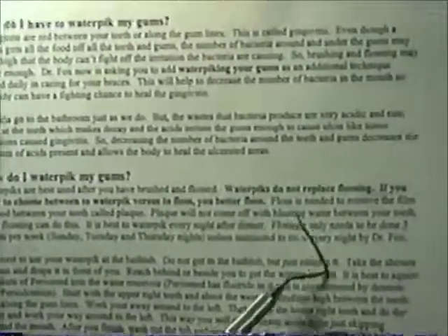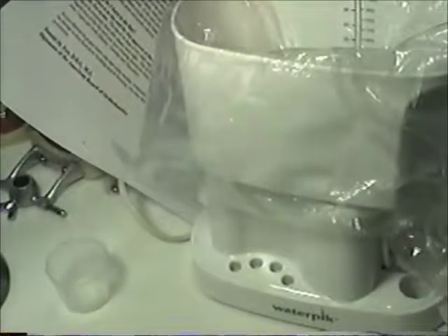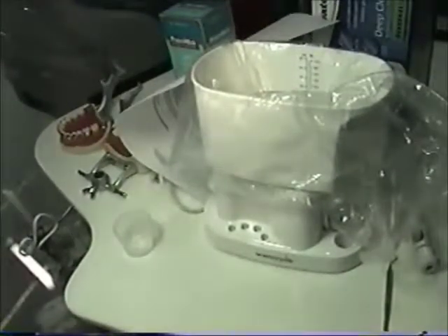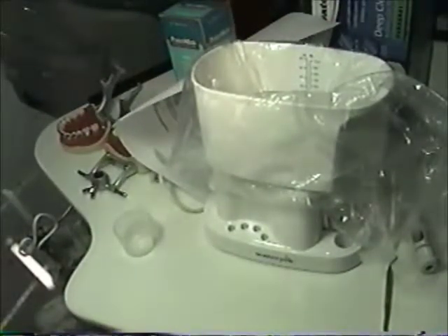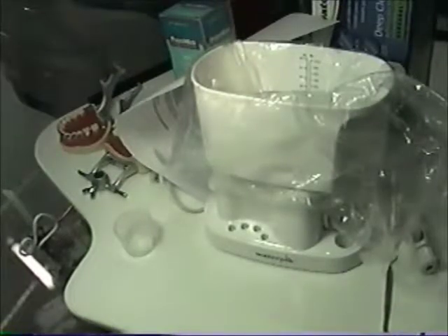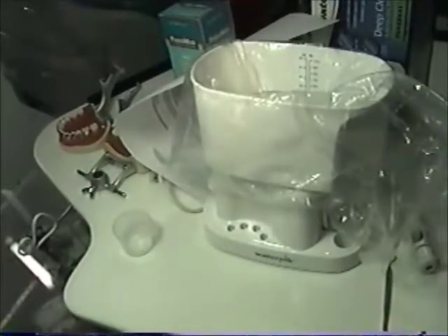Floss is needed to remove the film of food between your teeth called plaque. The plaque will not come off with blasting water between your teeth or under those gums. So that's what I want to end with: don't think, because I see people do this, that you should buy this Waterpik so that you don't have to floss. Flossing, I don't want no electric flossers, no other weird tools. You need to learn how to floss, and there are separate videos on this. So I hope this helps, and good luck with your water picking.